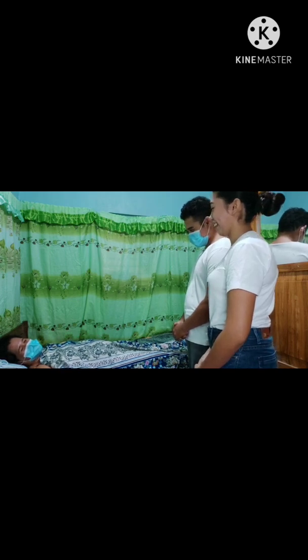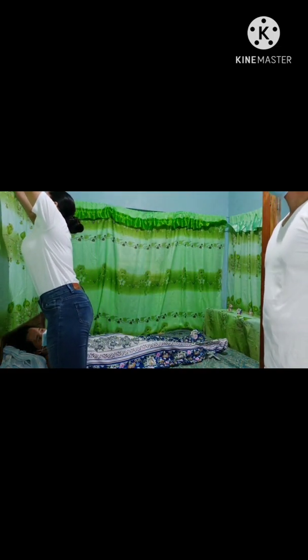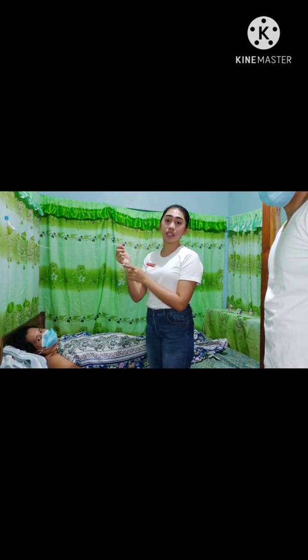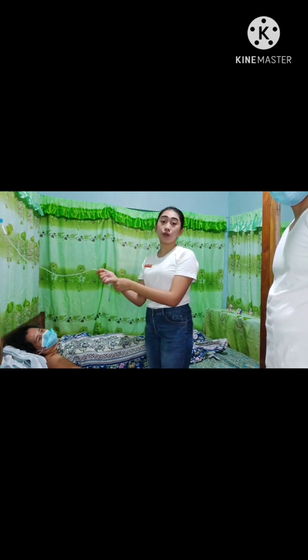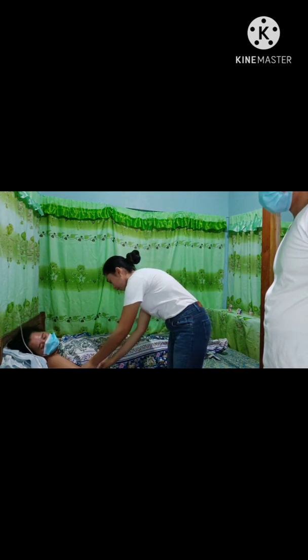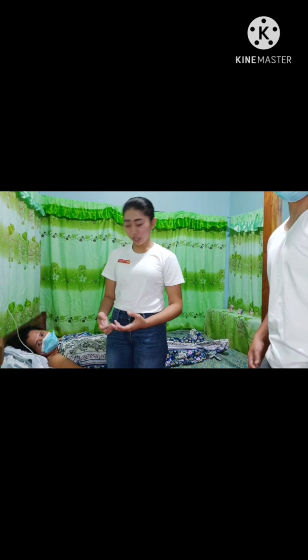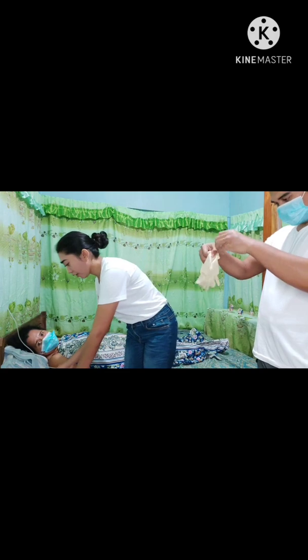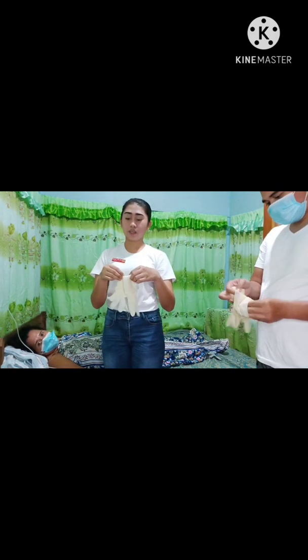Okay, thank you. So after that, I will put the IV fluids on the IV stand and place the IV stand where the patient's arm is lying. After that, make sure that the IV tubings are not dangling on the floor, which makes it easier for you to connect the tubings. So the next step is to give gloves to the doctor and then get another pair of gloves for the assisting nurse.